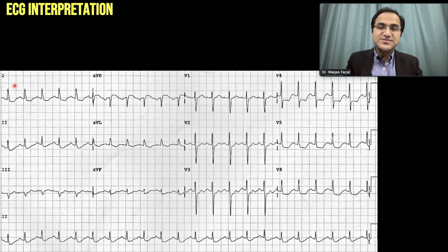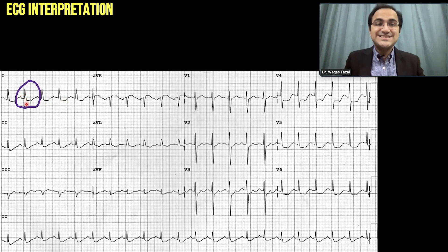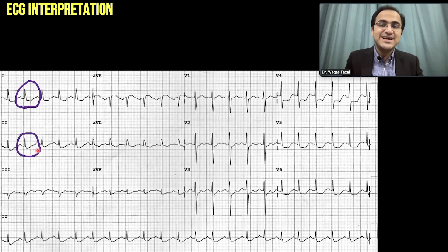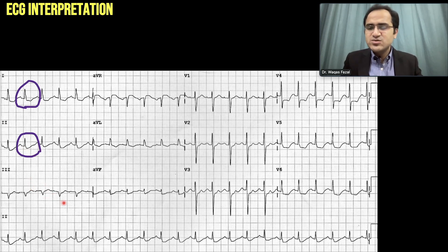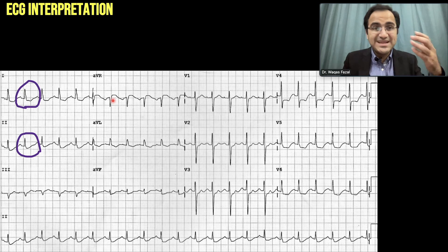Let us solve this ECG. Looking at lead 1, compare the P wave and PR segment with the ST segment — the ST segment is depressed. In lead 2, similarly, the ST segment is depressed. In lead 3, there is no ST segment depression, though the QRS complex looks wide. AVR is not showing ST segment depression; it shows slight ST segment elevation, but ST elevation in only one lead is not important — it requires more than 1mm in two or more contiguous leads, as discussed previously.